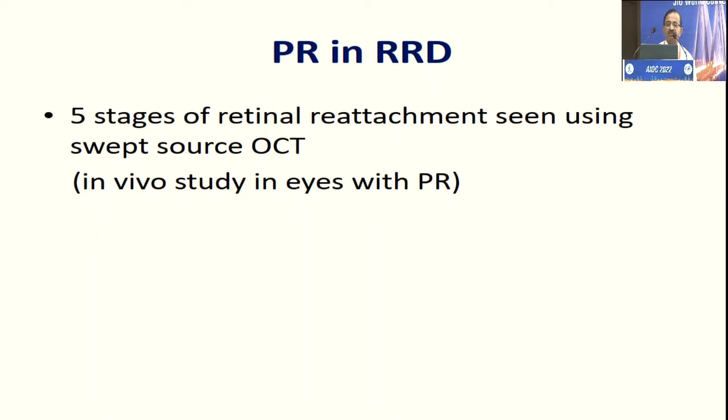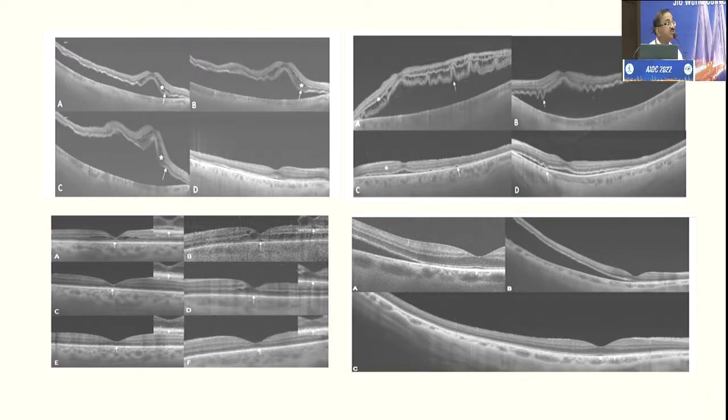And also with swept source OCT, pneumatic retinopexy has shown elegant figures where five stages of reattachment of the retina have been depicted as to how the retina reattaches post pneumatic retinopexy.